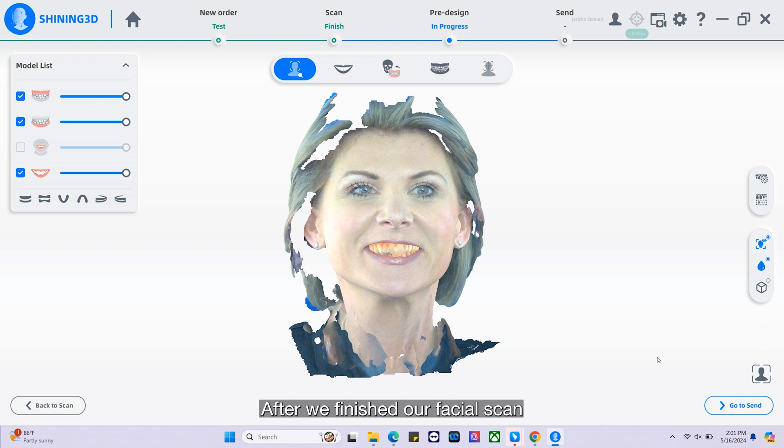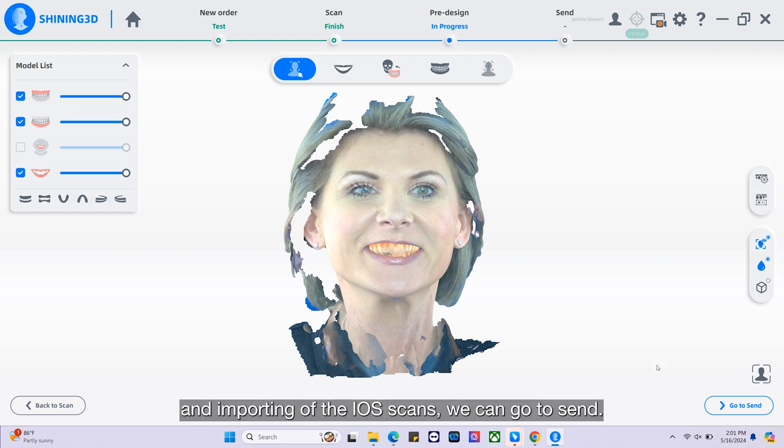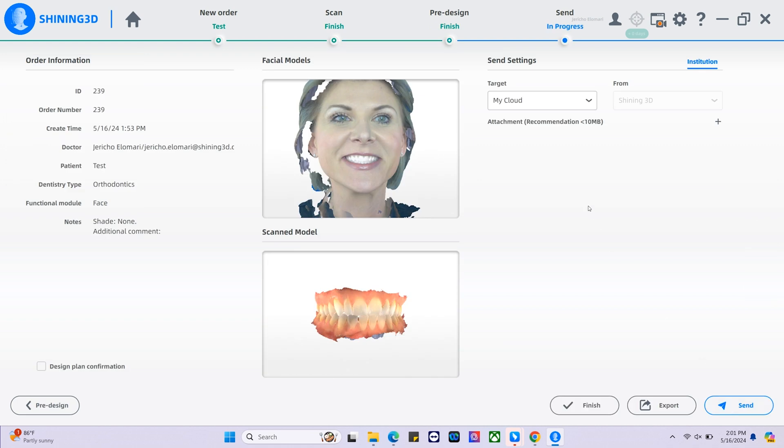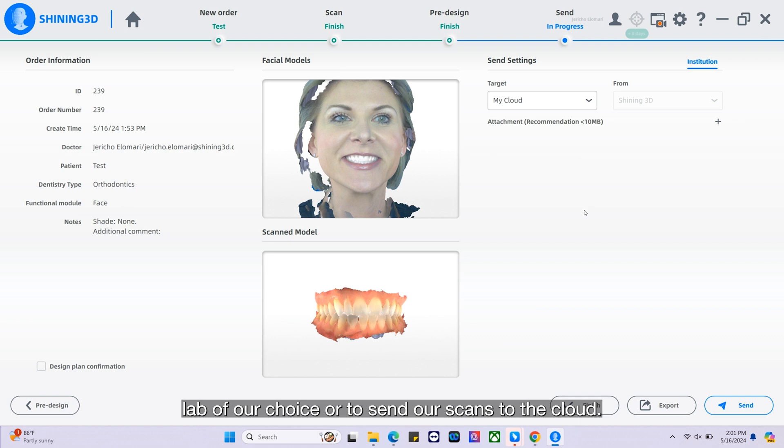After we've finished our facial scan and importing of the iOS scans, we can go to send. From here, we can choose a lab of our choice or send our scans to the cloud.